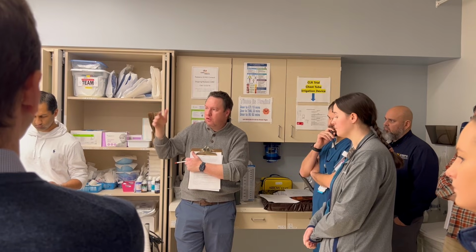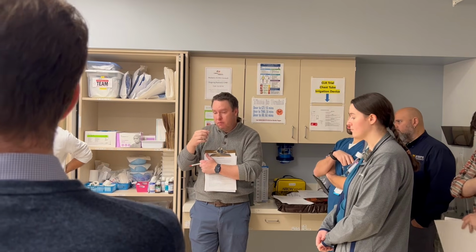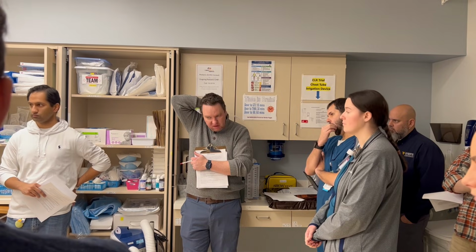You'll get a hold of the attending. We're always in-house. We'll screen if the patient's a candidate and then assist with sending out the page if we're going to activate. We never do ECMO in the ER here. The only places we cannulate are the pediatric cardiac ICU, the OR, and the cath lab. So all these patients have to be transported back, which is part of why we're going through this whole thing. I'll just be standing in the back. Andrew's going to run it here, and then he'll go through debriefing at the end as well.